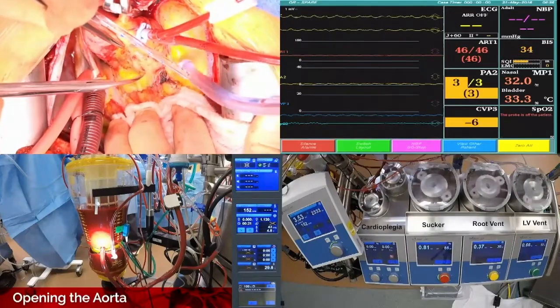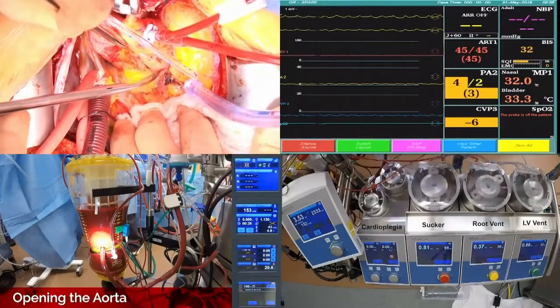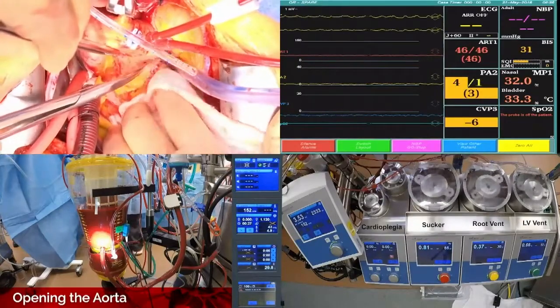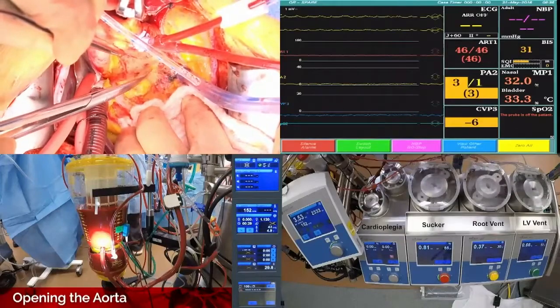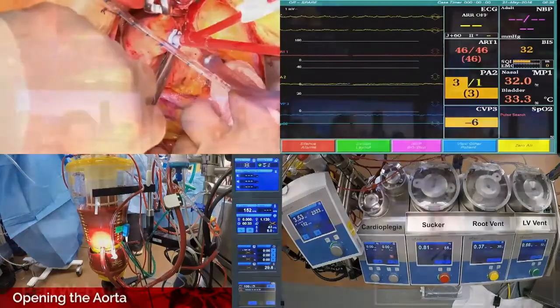Yeah. So for me, I did this, so I do this. You just basically take a drop sucker and just a weighted sucker. If it's a really big one, you can put a wiggly in, but otherwise I use a 10 or 12 French with a malleable wire in it, which, as you well know, took a while to get. Super handy. You can move it to different places.